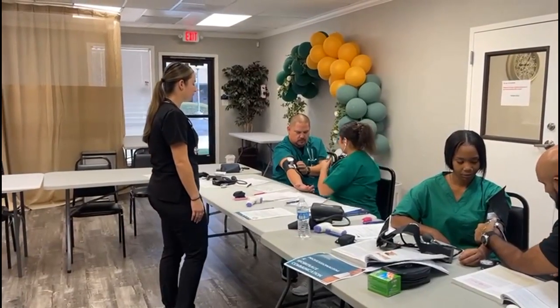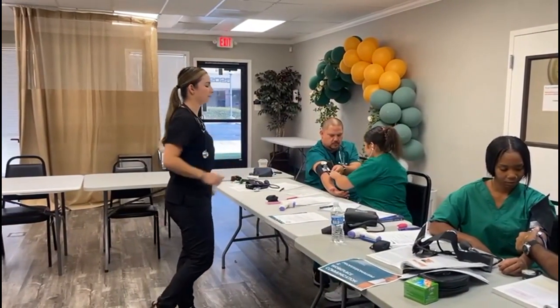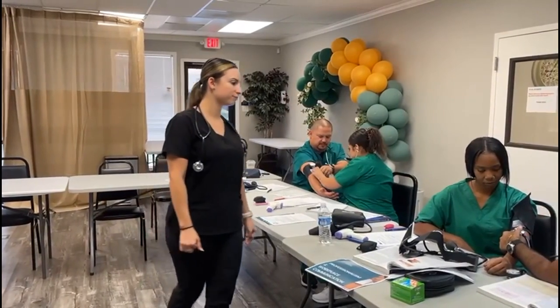Hi everyone, my name is Cassandra. I'm an EKG instructor at Altamont Healthcare here in Stockton. On today's episode, you're going to watch me guiding the students on a proper way to take blood pressure readings.